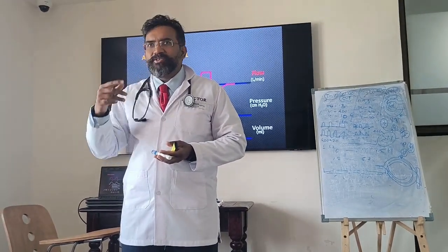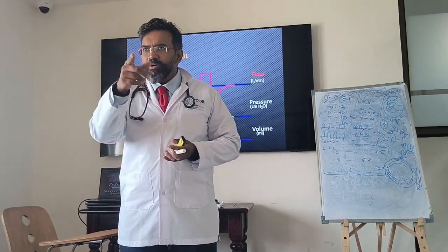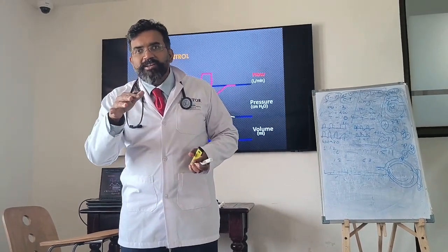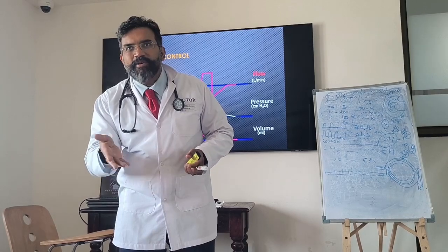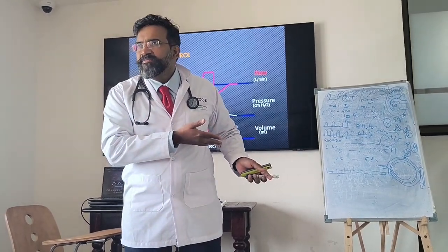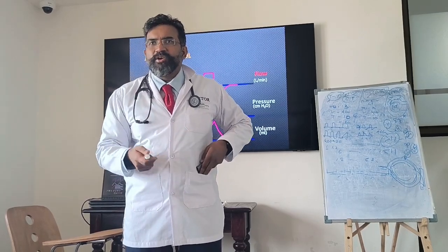Are you understanding? So the answer what he says is important. What he says is चलो टाइटल वॉल्यूम कम कर दो ना, हो गया कम हमारा. लेकिन टाइडल वॉल्यूम कम करेगा तो he will not get the requirement ना, उसका मेटाबॉलिज्म ज्यादा है इसलिए तो ब्रीथ कर रहा है इतना वो. Are you understanding? So you cannot reduce the tidal volume.